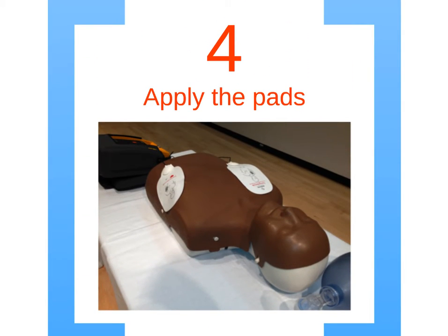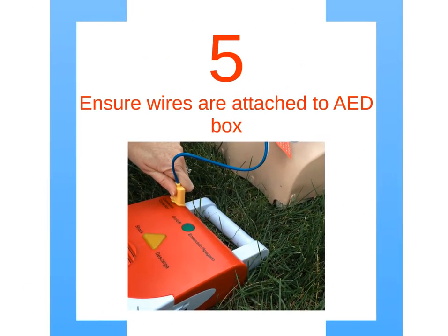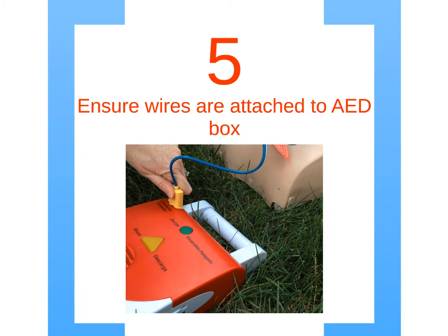Step 4: Put the upper right chest pad above the breast and the lower left chest pad below the armpit. Ensure wires are attached to the AED box.